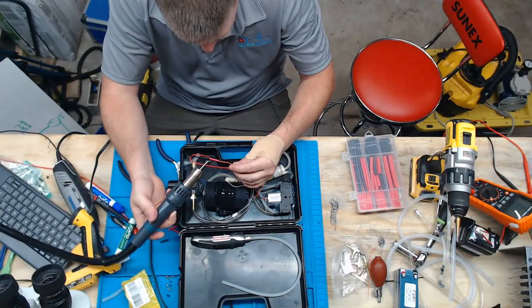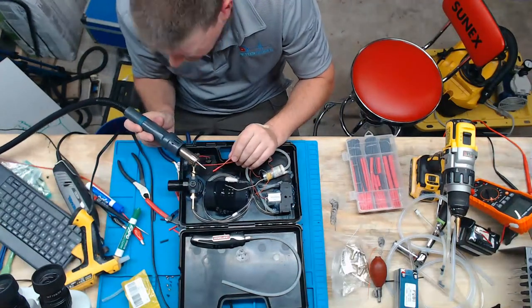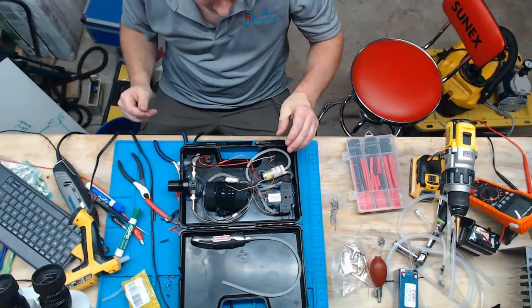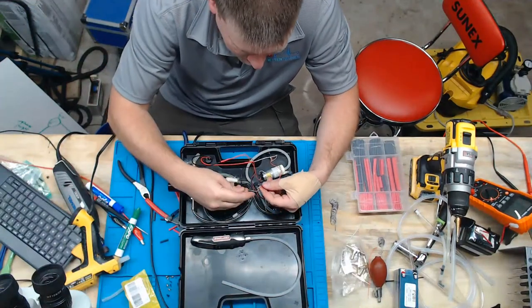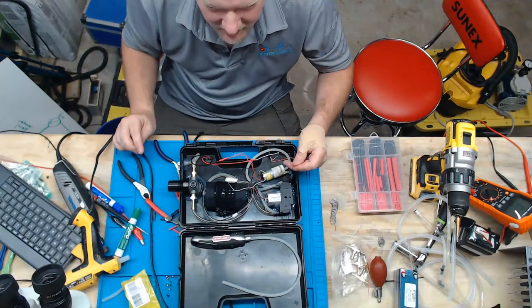So all the time I'm tinkering with stuff and playing around with different jigs and whatnot, and that's why I think this thing is going to be such an interesting piece. Even if it's not for me, I think this will be an interesting piece for somebody else maybe to learn from. Hell, I'll let somebody take it apart if they want.